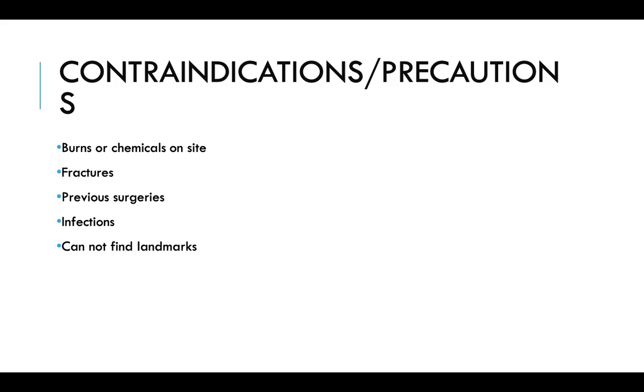Contraindications and precautions: burns or chemicals on the site of the IV or IO, fractures in the place of the IV or IO, previous surgeries, infections, and if you cannot find your landmarks.